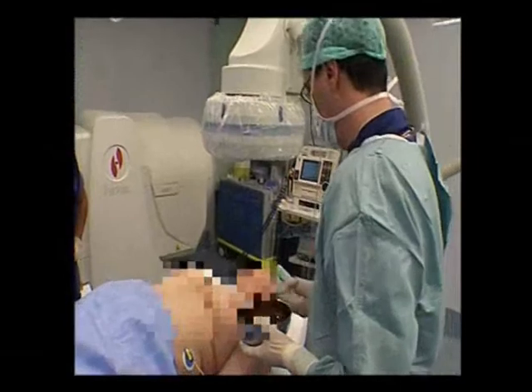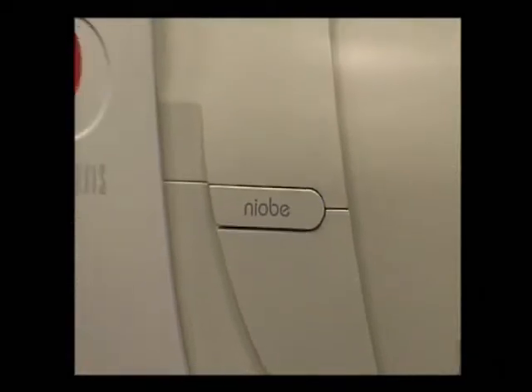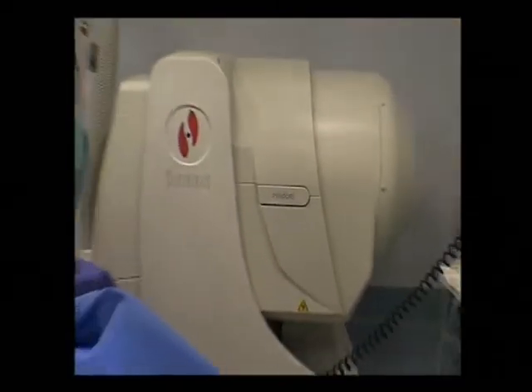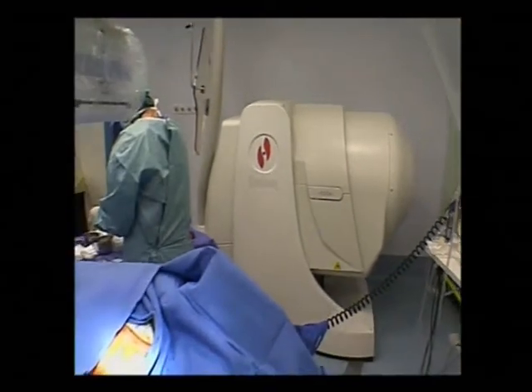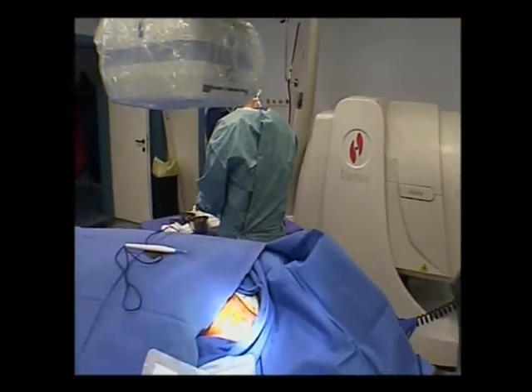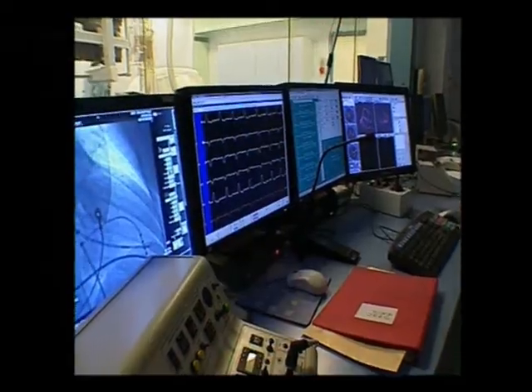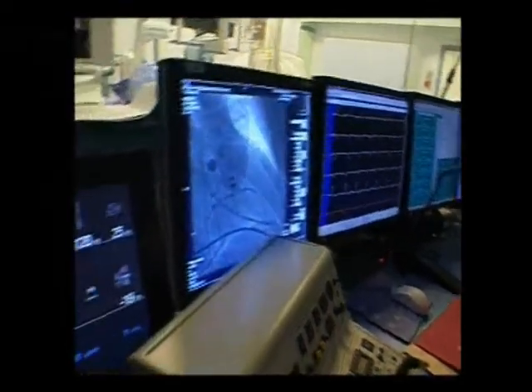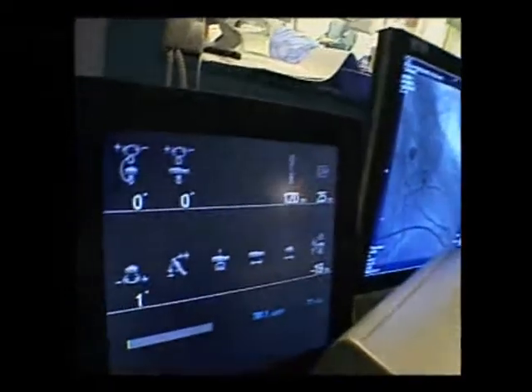The implantation is starting. This is our EP lab and this is the operating control room next to it.